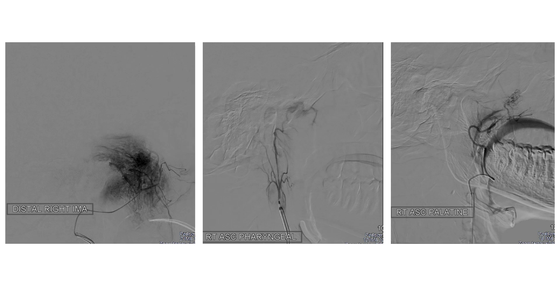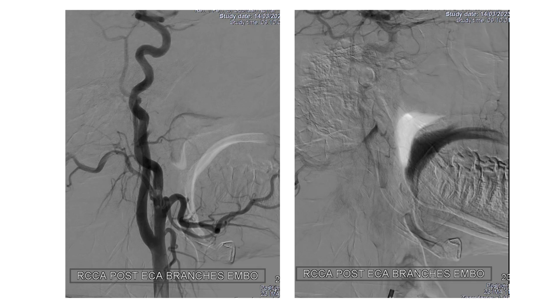This is a microcatheter injection of the distal right internal maxillary artery. We can see a large part of the tumor is filling with this. This was embolized. This is a selective run of a right ascending pharyngeal artery injection. We can see a small part of the tumor being perfused here. That was embolized. Notice the posterior division of the ascending pharyngeal is intact. This is an ascending palatine, a branch of the facial artery. There was some supply from this. This was also embolized. So 3 pedicles from the distal IMA, all embolized with PVA particles.